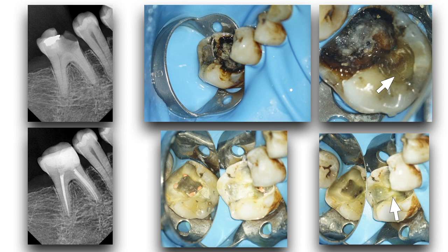So, from a scientific point of view, it is treatable. And I show the patient, here you have a crack, and the crack is in the coronal part. We are doing a root canal therapy. And I take a post-operative, and here I have a pre and a post, and I really advise the patient to wait at least about 2 to 6 months. Maybe 2 months is enough, but 2 to 3 months is very nice. But in some cases, maybe for another issue, I told him to wait about 6 months.